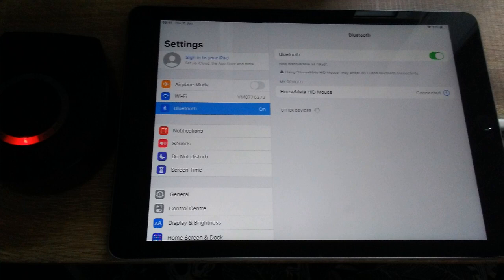But generally, what you'll need to do is ensure that the switch interface is charged first, then paired to the iPad. This can be done by going into the Bluetooth settings on the iPad, making sure that the Bluetooth is turned on your iPad, looking for the device on the iPad settings, and then clicking on it to pair it to the iPad.